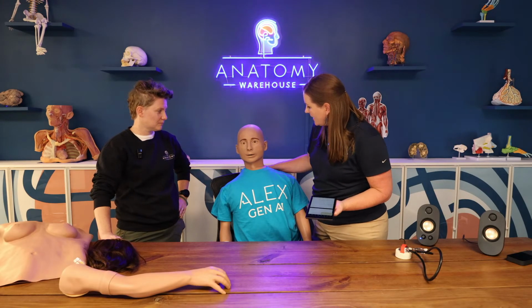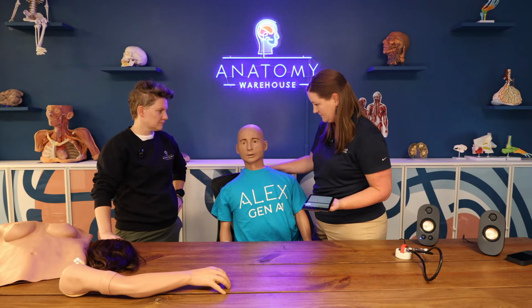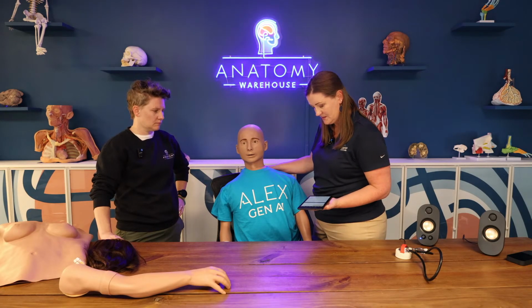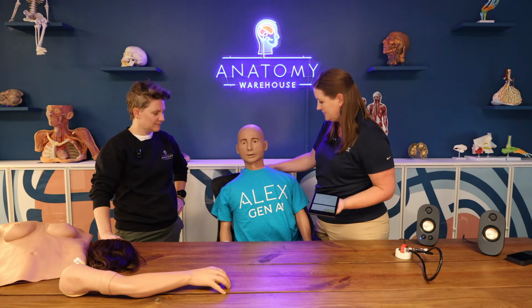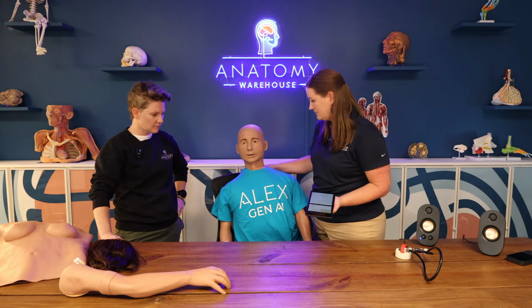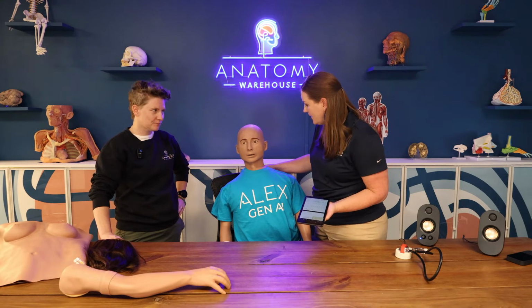Okay. And how are you feeling? I have a headache and I'm a little nauseated. Okay. Have we given you anything yet? No, I haven't had anything to drink yet. Okay. Can you tell me a little bit more about your accident? Were you wearing a seatbelt? No, I wasn't wearing a seatbelt. My colleague was driving and I was sitting in the passenger seat. Okay. Andrew, have you had anything to drink today?